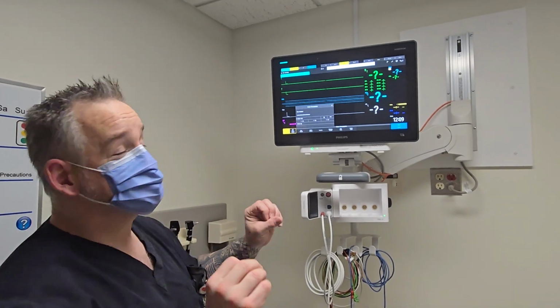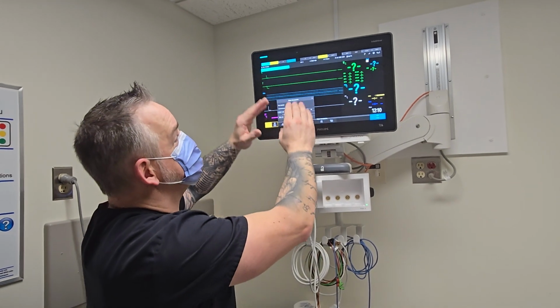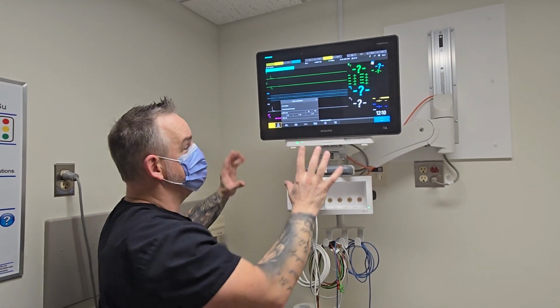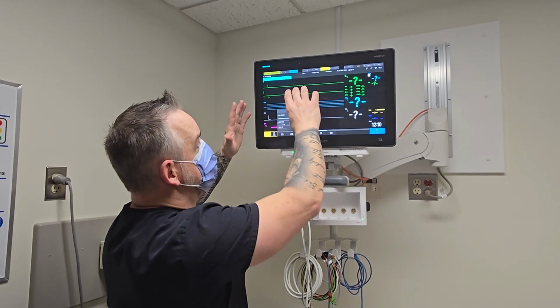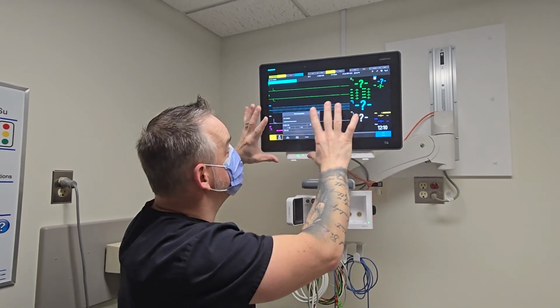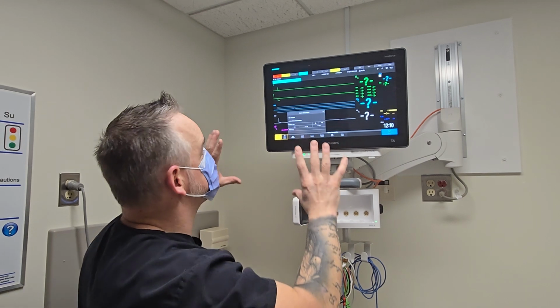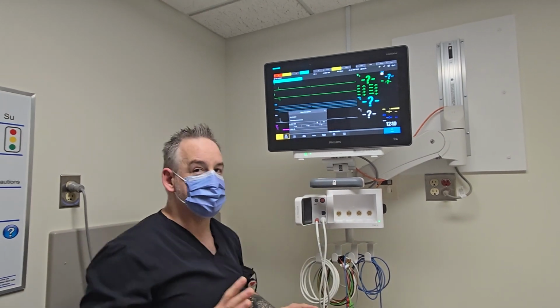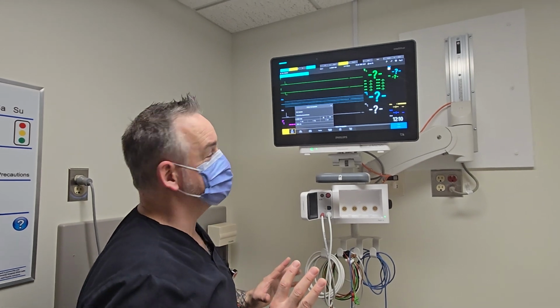Now, once in a while, you may see another screen asking you, there is data stored on the monitor. It's talking about the screen, not the box. If there's data stored on the monitor, we do want to delete that information. We're not storing information on the monitors. So that's the one extra window you might see. I hope that kind of explains it for you. And that's it.